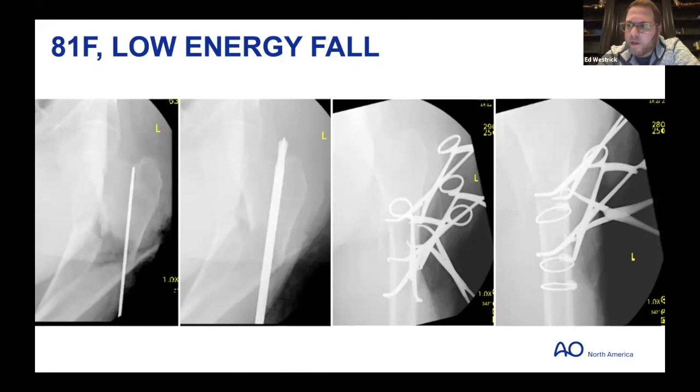And at that point, we make an incision where we normally would, proximal to the greater trochanter. And we've already established the start point. And so at that point, the ball tip guide wire is just dropped into the start point that we already established. And we've already established it in reverse.